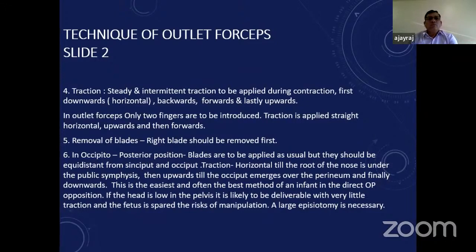This is the easiest and often the best method for an infant in the direct occiput posterior position. If the head is low in the pelvis, it is likely to be deliverable with very little traction, and the fetus is spared the risk of manipulation.